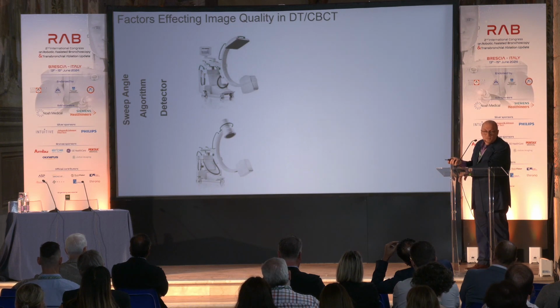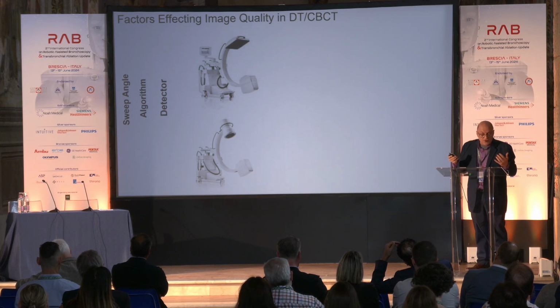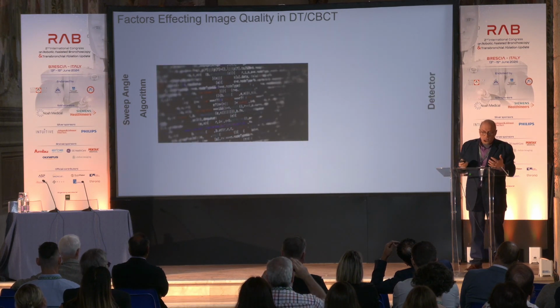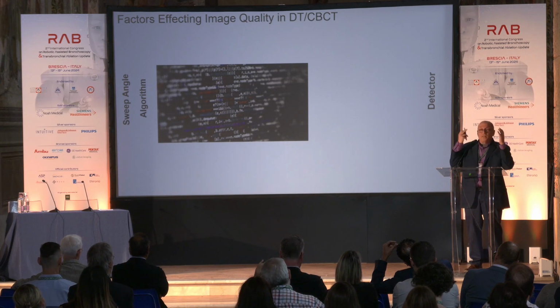Well, the detector makes a big difference. If the detector is small, like a 9-inch analog, it might be very different than, for instance, a flat panel digital, okay? So the detector is very, very important. The reconstruction algorithm becomes very important.